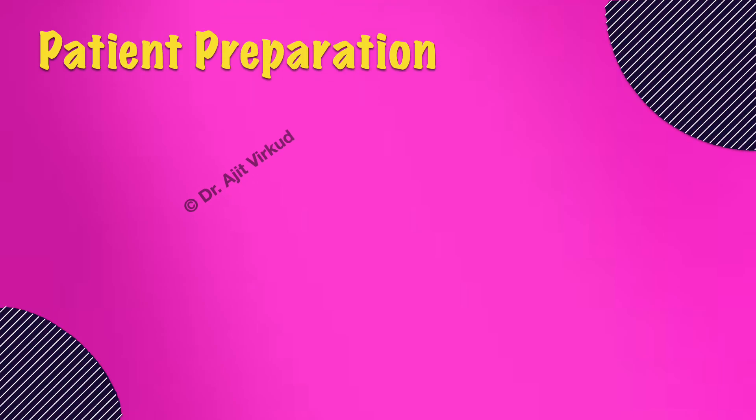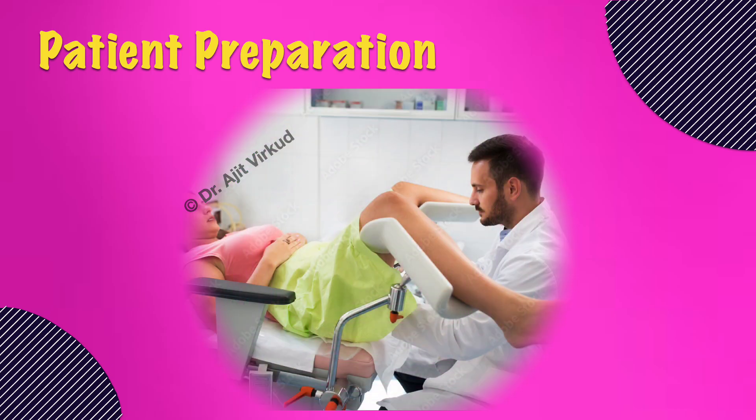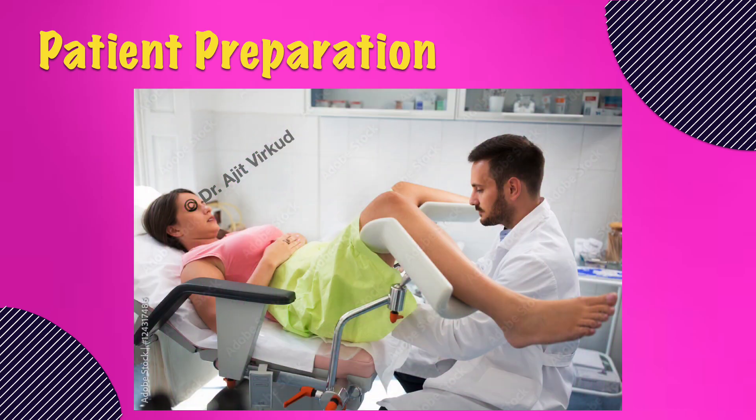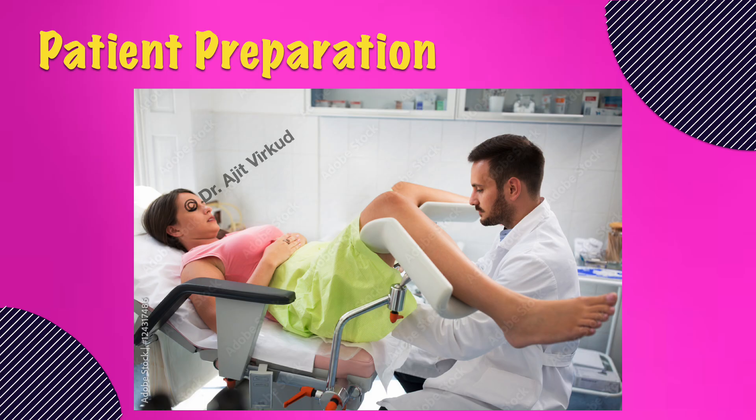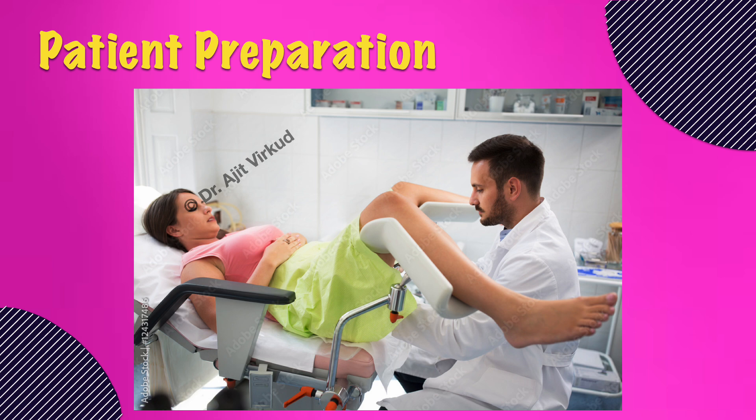Prior to conducting a per speculum examination, provide the patient with a comprehensive explanation of the procedure and obtain her informed consent. Prioritize the patient's privacy and comfort. Instruct the patient to void her bladder completely. The optimal position is dorsal lithotomy with appropriate draping in place. It is imperative that the buttocks be positioned well beyond the edge of the examination table, especially during surgical procedures. Adhere to strict aseptic practices throughout.